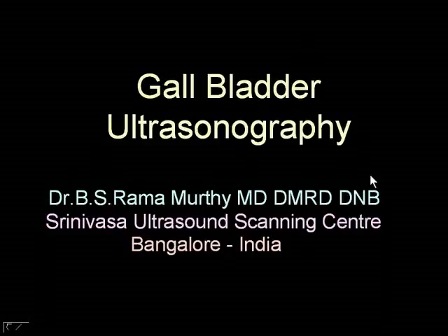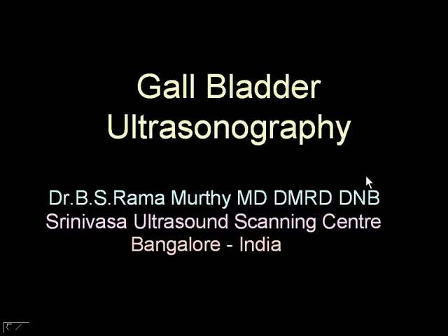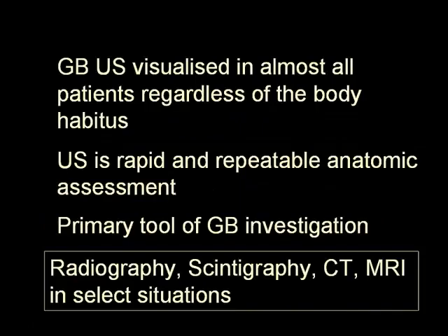Gallbladder revision now. Okay, it's a mundane topic, but this is an effort to let us know a few tricks and a few maneuvers which will really get us out of a lot of sticky situations.